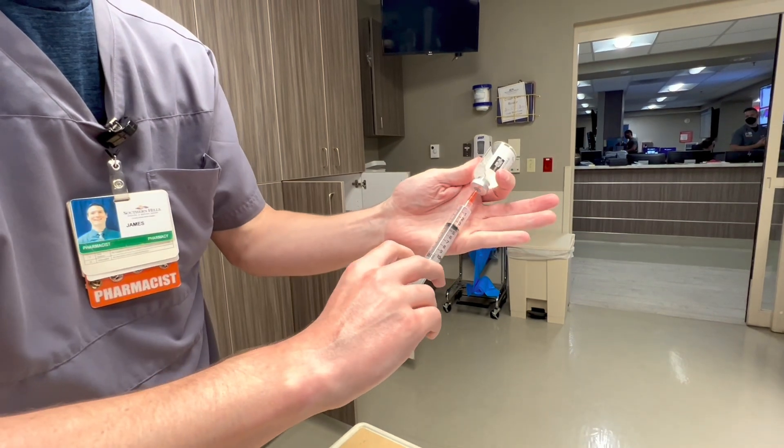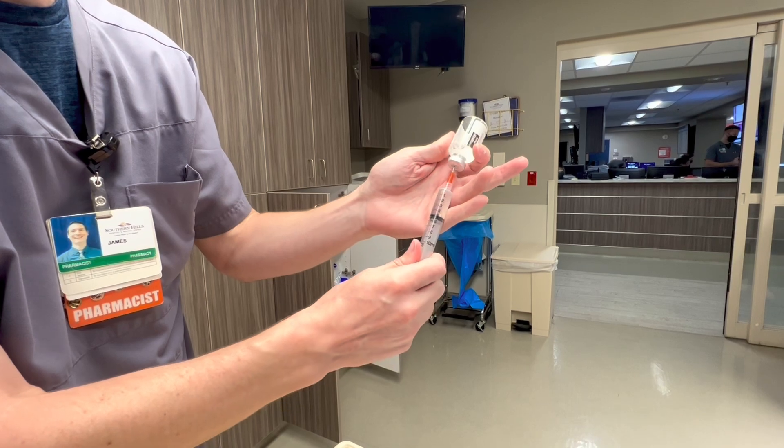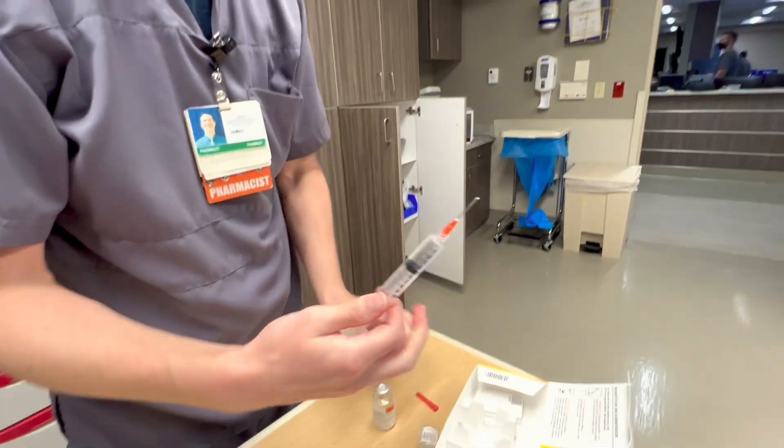Then you'll just draw up your dose. For our patient, it was 5 ml's, which is the max — 5 ml's. Draw it up and you're ready to give.